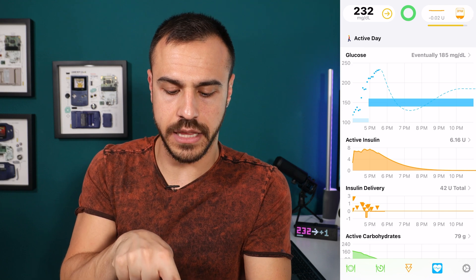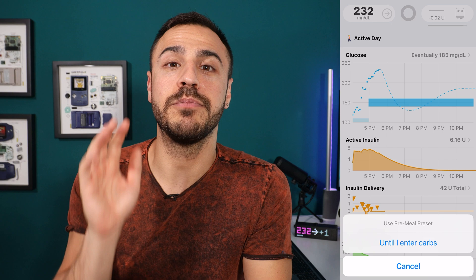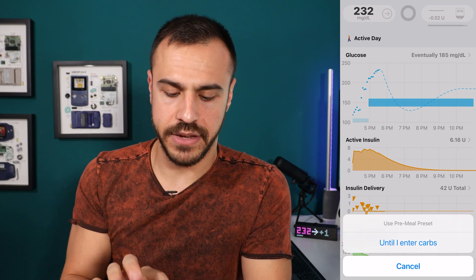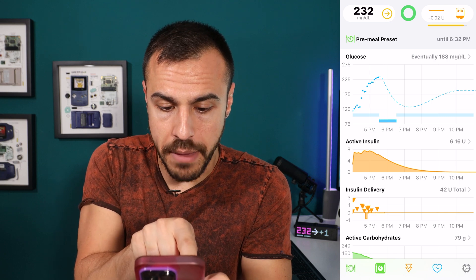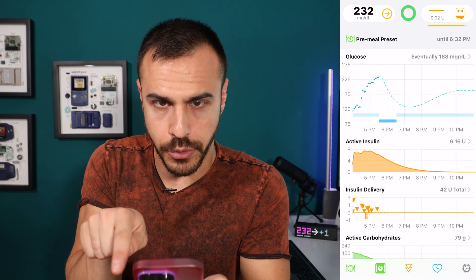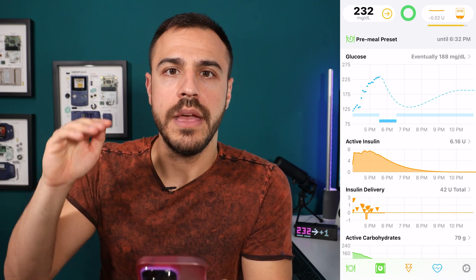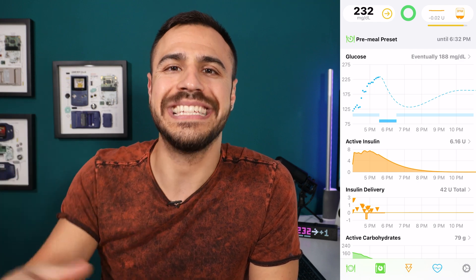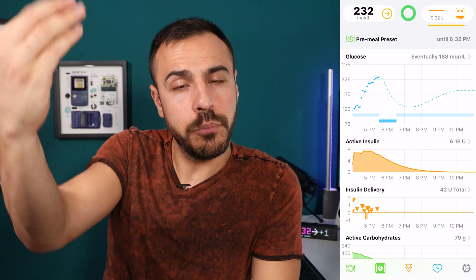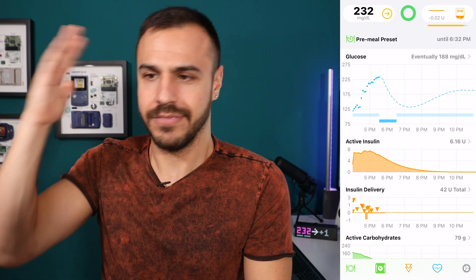Next to the plate is another plate and fork icon. When you tap that, this is called a pre-meal preset. Watch what happens — it lowers the target range below my main target range. That means until I eat carbs — I think it goes on for one hour or until I eat carbs — it lowers your target range in anticipation of you eating, meaning it's kind of bringing you a little bit lower so that the carbs don't hit you as hard. Amazing.